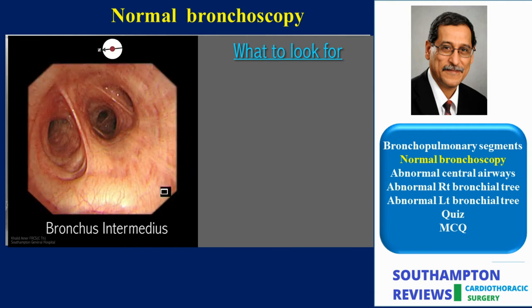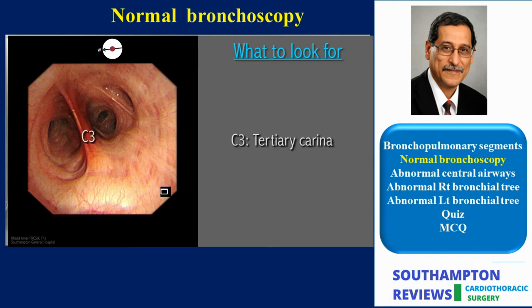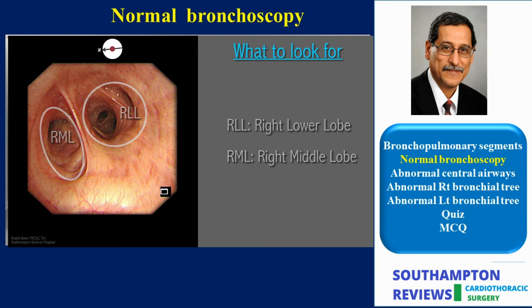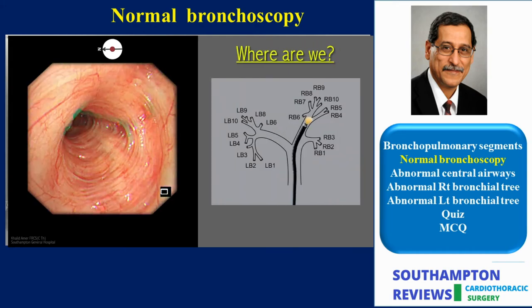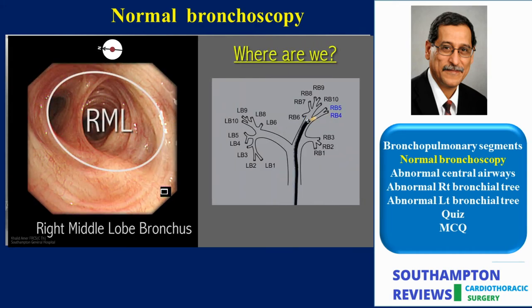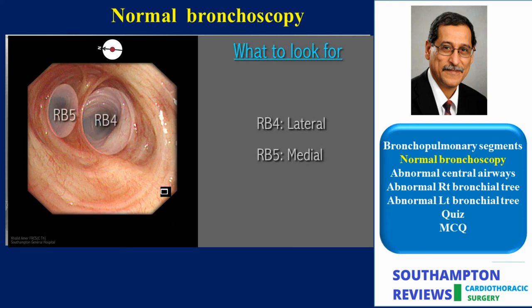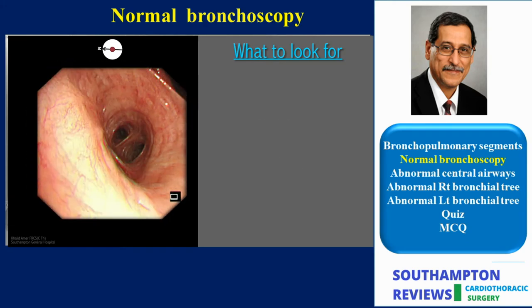I hope by now we have got used to the habit of seeing carina first. If so, let's identify the tertiary carina between the middle and lower lobe, and also make note of the next level of division — the quaternary carina between the apical lower and common basal segments of the lower lobe. It is of paramount importance to appreciate the hierarchy of the carinae and the higher or proximal origin of the tertiary carina in relation to the quaternary carina. We will start by examining the middle lobe bronchus, which divides into two segmental bronchi: the lateral or RB4, and the medial RB5. Next we will move to the common basal segments of the right lower lobe.